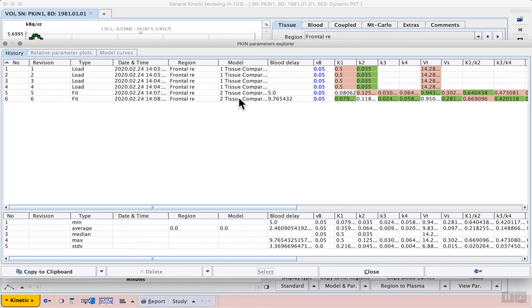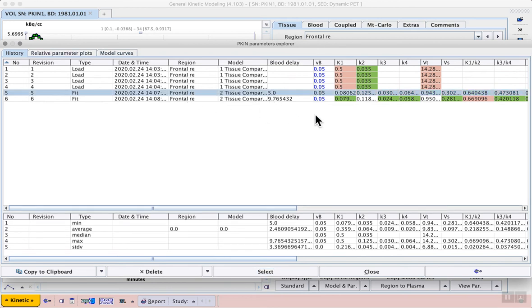What we are most interested in are the two lines with the data from the two tissue compartment model that we selected for fitting. In row 5 we see the first fit where we had our manually entered blood delay of 5 seconds.